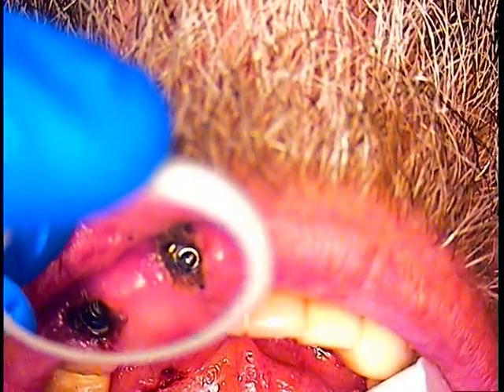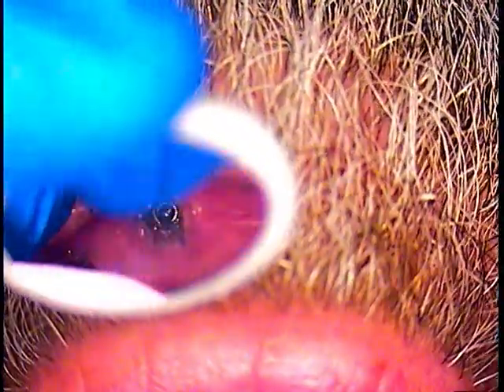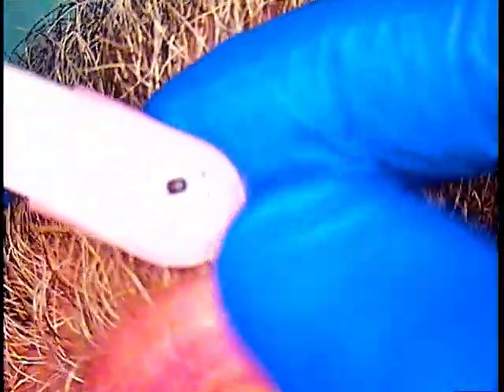There we go. Put that in place. And you can see it's laying on its side like that. That's kind of cool. Let me just see if you can see that. All right, that's better focus there. Yeah, so that's the other screw. Let me get him a little bit higher. This is the one closer to the top of the lip, so it's not as easy to retract. But we're doing a good job. There it is. And it's just lying on the side, so now my assistant is going to go in and put the suction tip flat right on top of it. Creates a vacuum. And there it is, number 2 right there waiting for us.